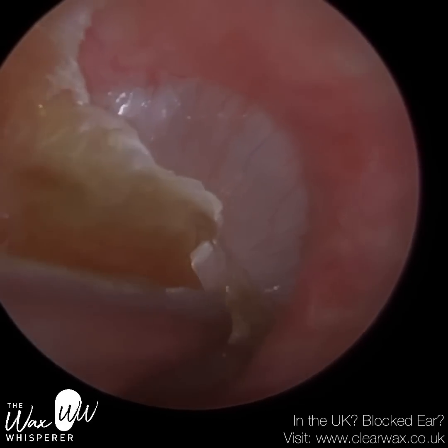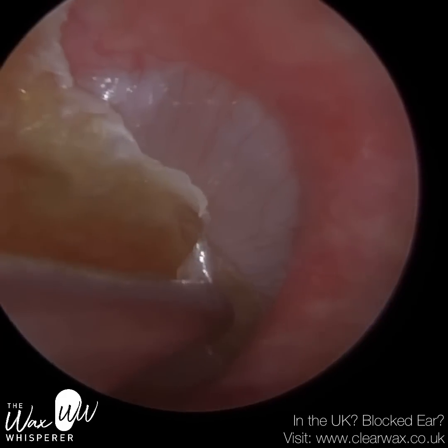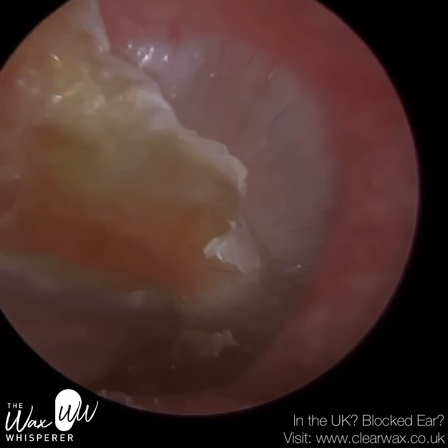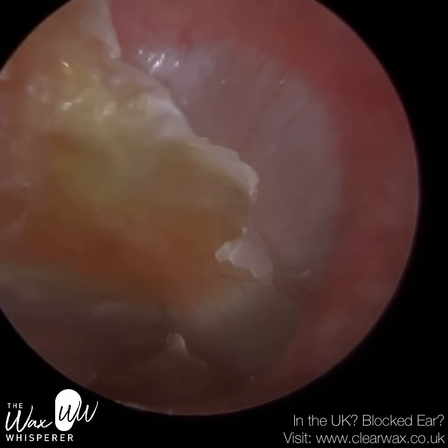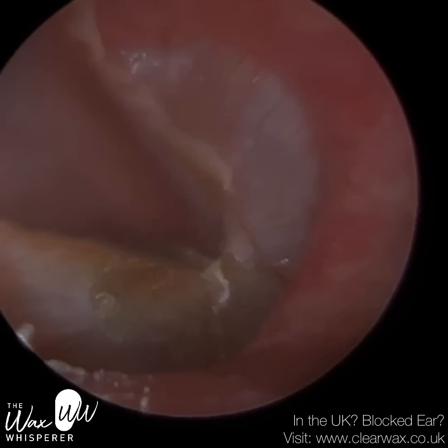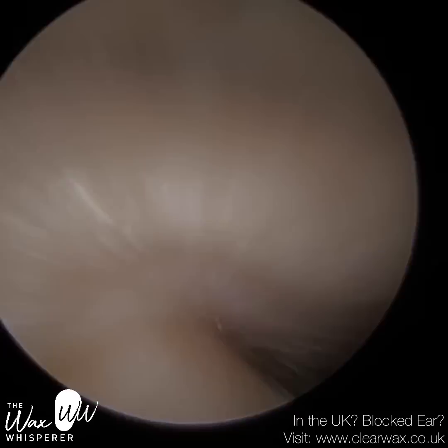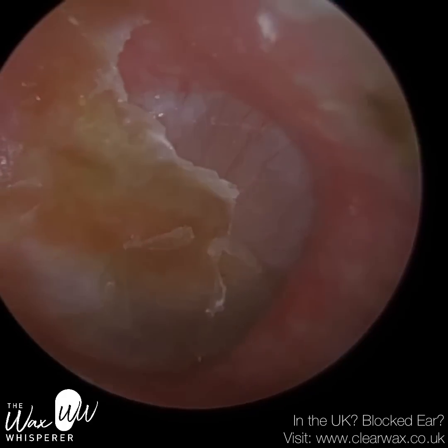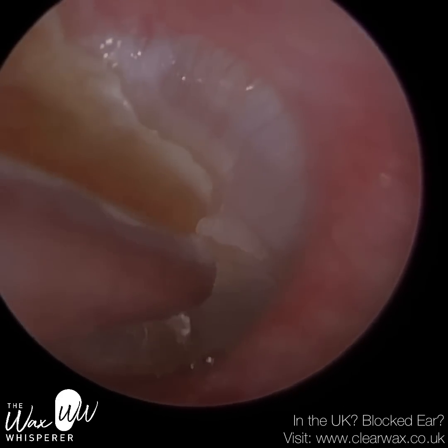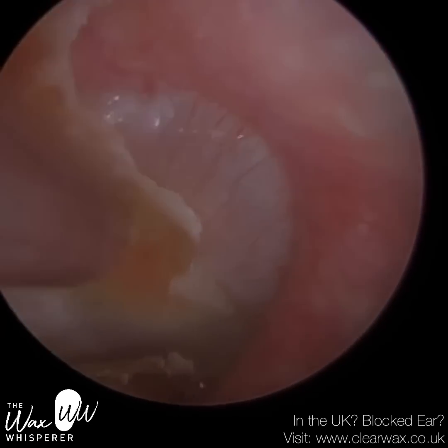You can see the contrast now — the back part of the eardrum shows the fresh layer of skin and you can actually see the blood vessels and capillaries there. I've got this thick layer that I'm trying to really tug away. Whenever you're this close to the eardrum, you have to be so careful and gentle because one false move and we could quite easily perforate this patient's eardrum. The patient is very still, which definitely helps. Currently we can probably see about 30% of their true underlying eardrum.